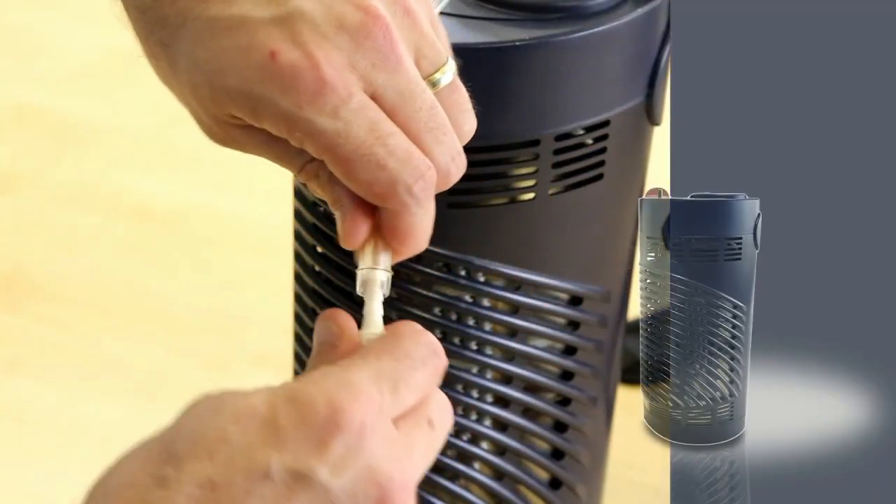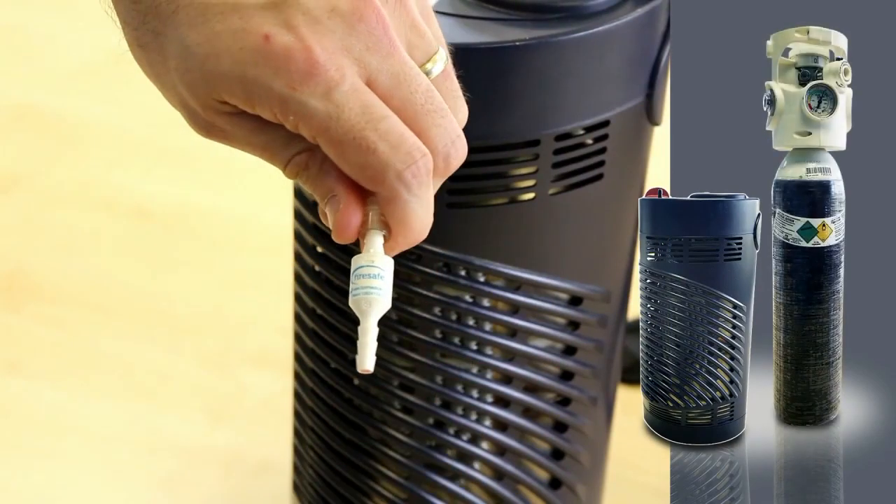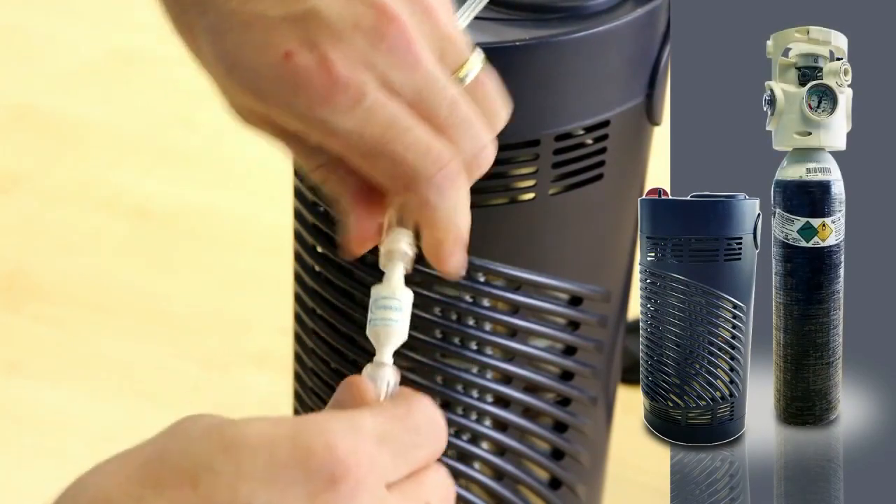Fire brakes are compatible with all oxygen supply modalities: gas, liquid, and concentrator supplies.